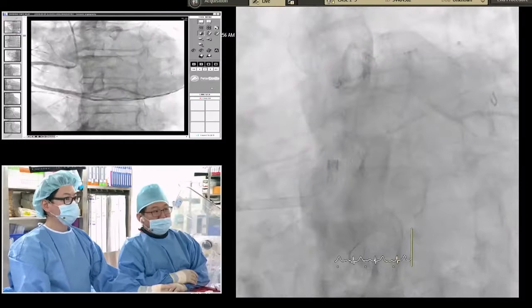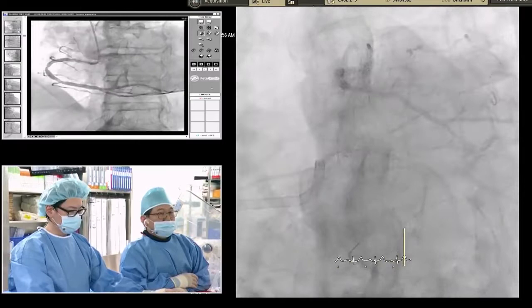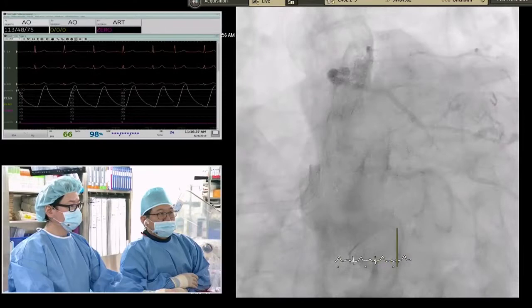Why don't you do the circumflex as a negative FFR? So you don't touch the circumflex? Well, I would personally FFR the circ, and if it was positive, then I'm going to do a two-stent technique and try to treat it. All right, absolutely. I agree with that.